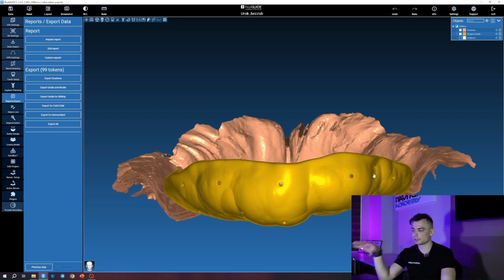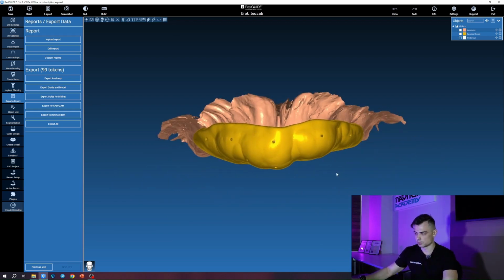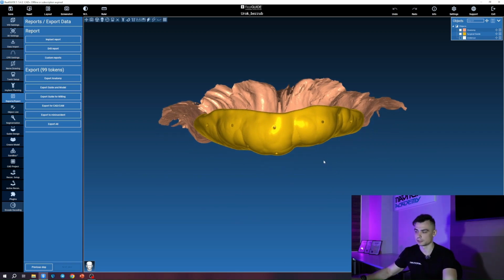That's why during the CT scan, you explain to the patient or to the radiology technician you're working with, or to your assistant, or you control it yourself, that this template should be pressed either with the opposing teeth, or someone holds it in place with the tongue, or there's a special bite block for the CT scan, meaning on the CT machines themselves, or for example, a silicone bite block that you make yourself from silicone.